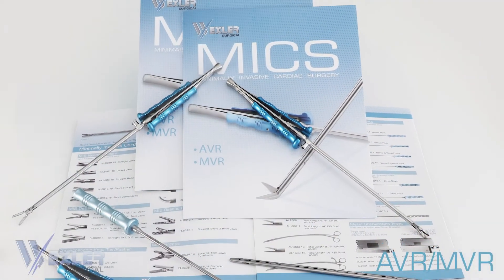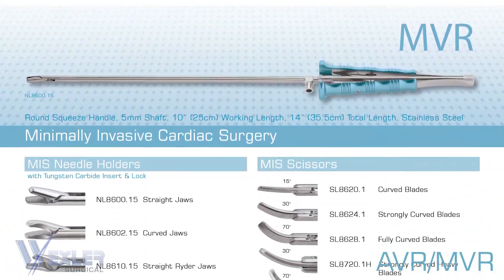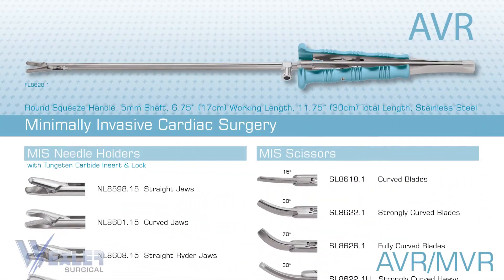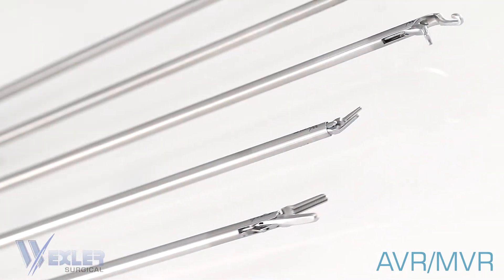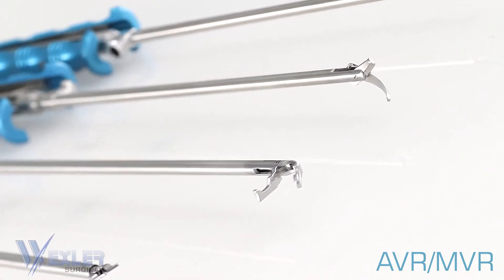At Wexler, we offer instruments of the highest quality for both MVR and AVR procedures. These instruments are part of our minimally invasive line and they include forceps, scissors, and needle holders.